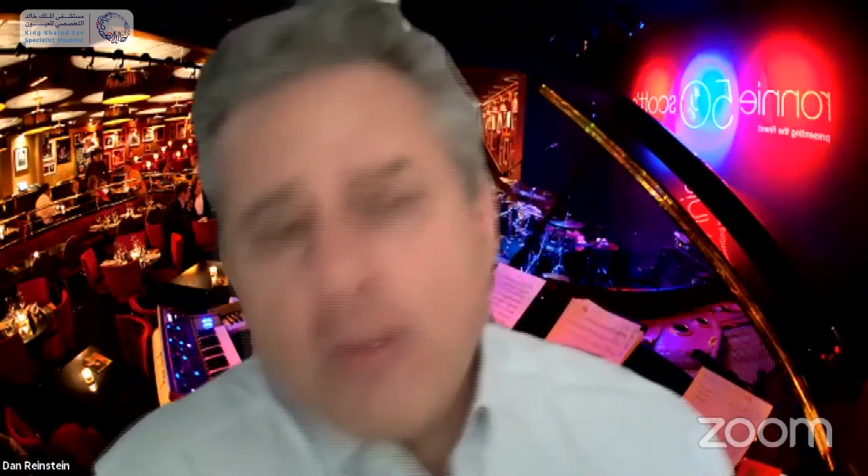I don't particularly worry about correcting up to 4 or 5 diopters of cylinder in the hyperopic or the myopic direction. I consider them to be pretty equivalent in terms of accuracy and efficacy. The advantage of the hyperopic cylinder is that you are myopicizing the cornea, and vice versa. And you could be reducing a positive spherical aberration with one and reducing negative spherical aberration with the other. So looking at all the factors before you start would be the way you would plan it.